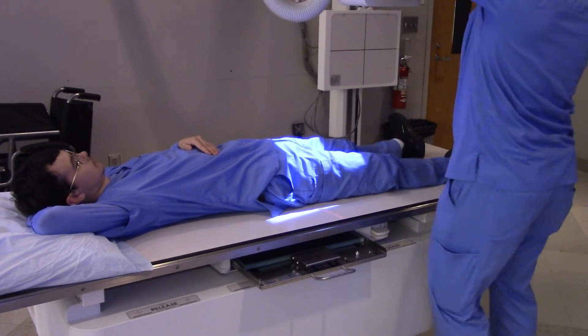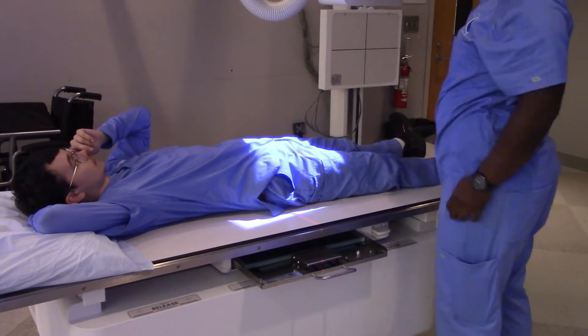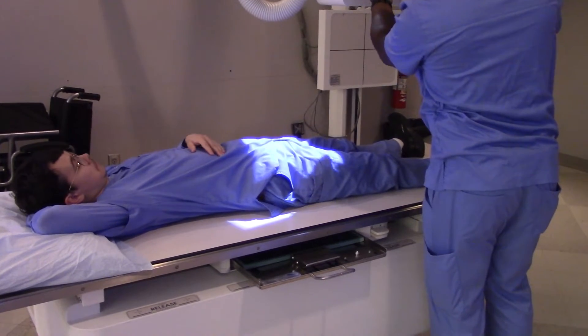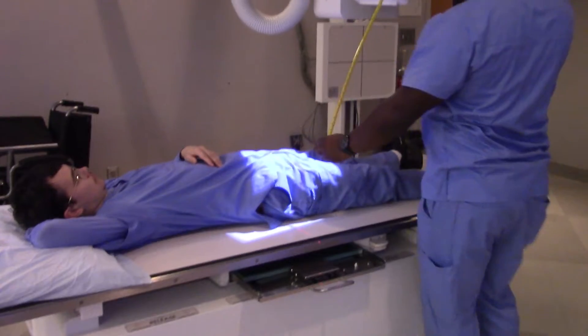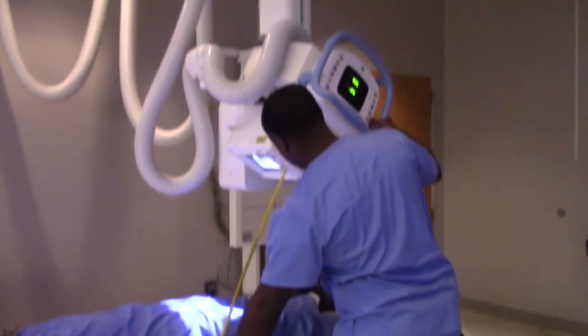So for a male patient, how much angulation do we need on this? As Evan said, 20 to 35 degrees. And we're going to try to get a 40 inch SID if at all possible. Correct.